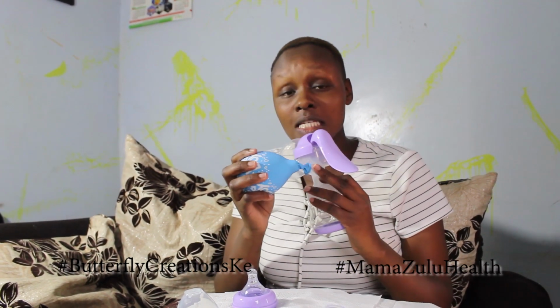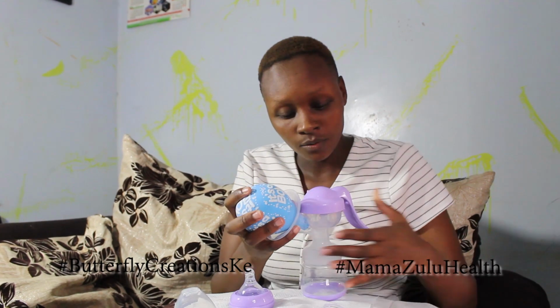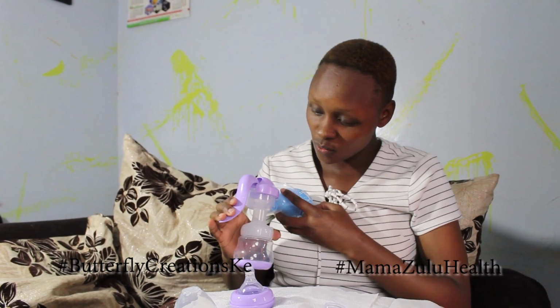Then this, assuming this is the nipple, you place it inside here, and then this is the other breast. So you get your, I like doing, sorry, mimi Mkikuyu, I like doing with my right hand so that it's very comfortable. So tuseme iko hapo, you just press.